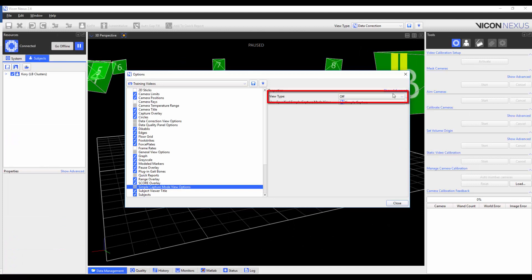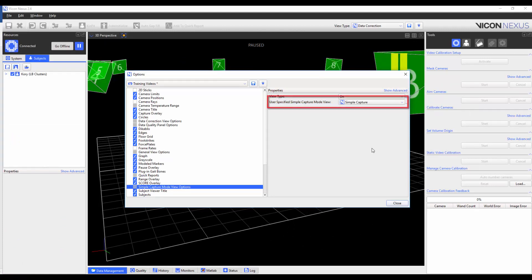If you set this to on, the user-specified Simple Capture Mode view that you have selected from the lower drop-down menu will turn on when you enter the Simple Capture Mode. You can select which view type you want from the second drop-down menu. In this case, I'm selecting Simple Capture.